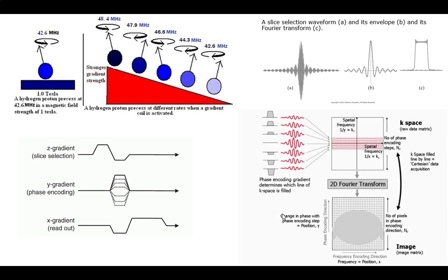When you're doing it, it's nice, for instance, to move over to the side. Now, one way you could do it is to go up and then go over. You hit it with a 180 pulse and you're down here, and then you do a readout. We'll take a look at some of these combos. The last half to two-thirds of my slides are all showing you different pulse sequences. But I want the idea to make sense before we go through, because this is all the magic. The rest of it's just working out. If you understand this idea, you've got it. So what other questions do we have about what these mean, how those encodings work?